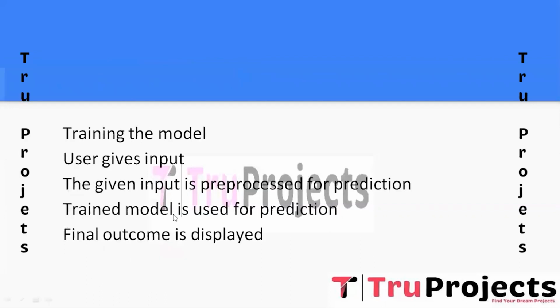And the sixth step is training the model. The training process involves feeding the pre-processed retinal images into each algorithm and adjusting the model parameters to minimize the prediction error. The model's training involves multiple iterations to fine-tune the weights and biases and optimize the performance.